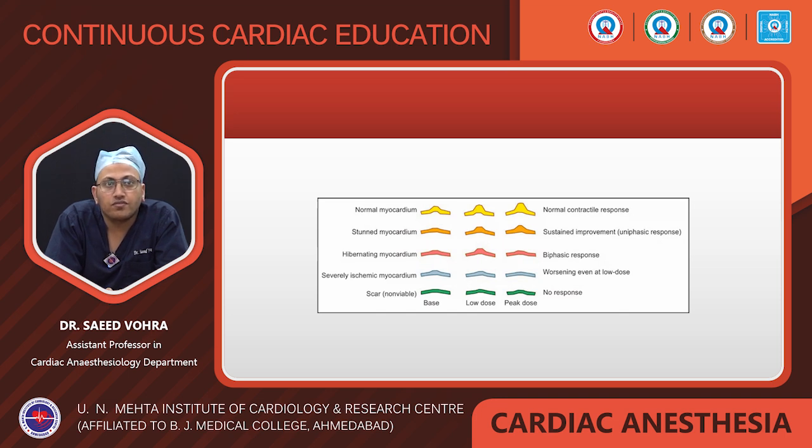Then if there is a severely ischemic myocardium, the contractility is less at rest and it does not have any response to dobutamine, and it worsens even at a low dose of dobutamine. In scarred or non-viable myocardium, there is no response to the dobutamine stress test.